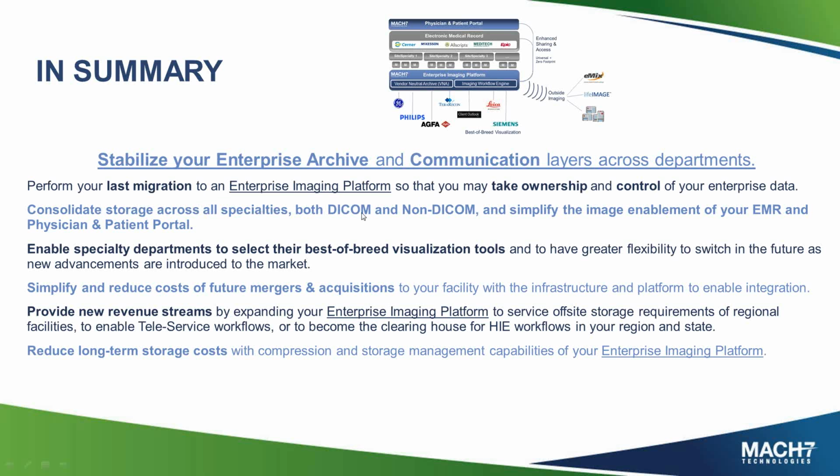Consolidate across all your specialties, both DICOM and non-DICOM. Once you've done that, you've simplified the image enablement up to the EMR. You've simplified the image enablement up to that portal. With that enterprise imaging strategy, enable specialty departments to select their best-of-breed viewers. Select a VNA that supports having other diagnostic specialty viewers integrate to it. Enable that flexibility and further enable the flexibility of those physicians to switch. You don't need to get locked into a visualization tool for the next 7+ years.